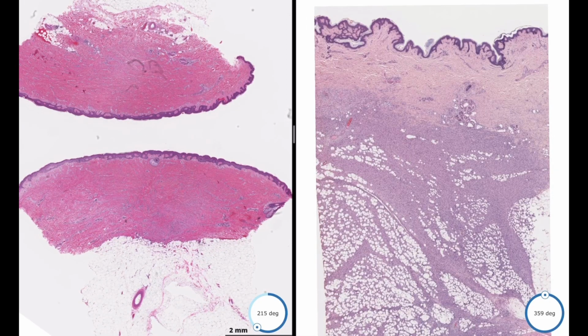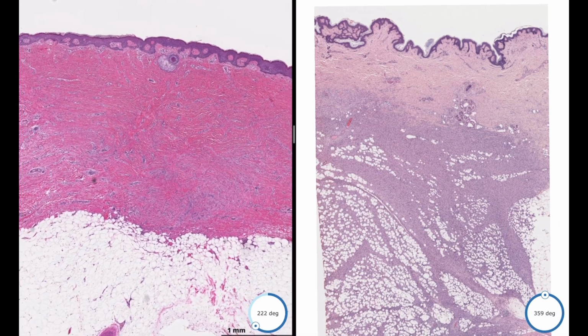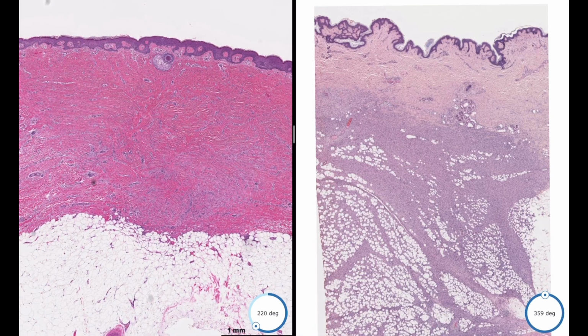Hey, today I'll cover the basic differences between dermatofibroma and dermatofibrosarcoma protuberans, DFSP, in 2 minutes. Of course, there are so many variations and different microscopic features and subtypes of each entity. In this video, I'll cover the main ones, starting with dermatofibroma, which usually has a jagged pattern, as you can see, like here, these areas. These are considered as a jagged pattern.